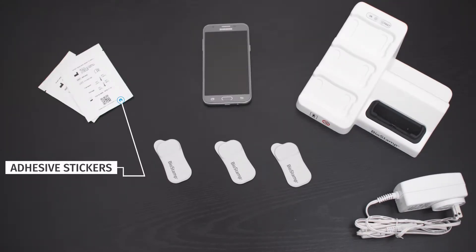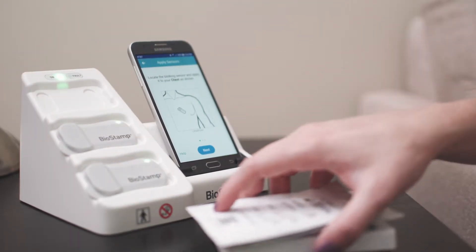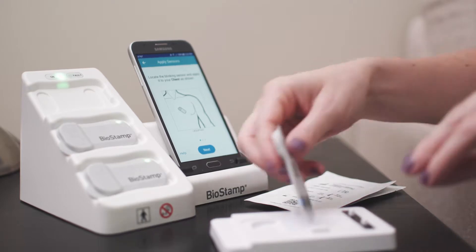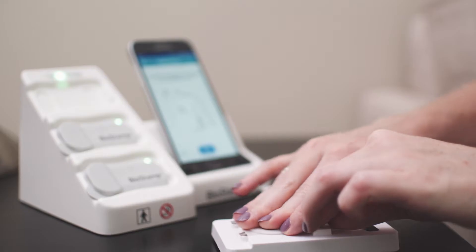The Biostamp Endpoint Remote Kit comes with all of the tools needed to implement daily remote data collection and monitoring. Following simple system setup, subjects are guided through Biostamp Sensor application steps via clear instructions presented in the LinkApp mobile device.